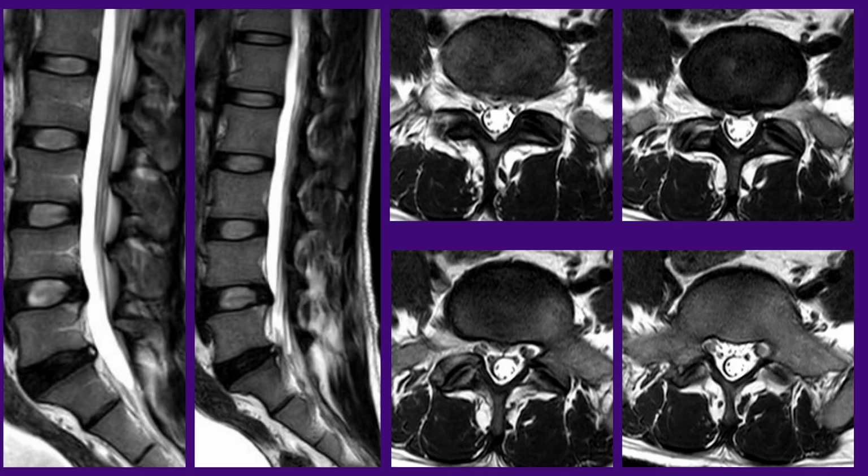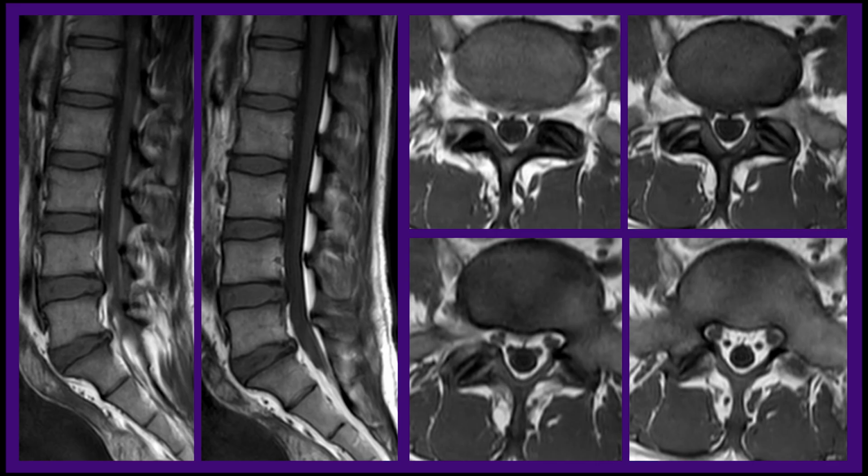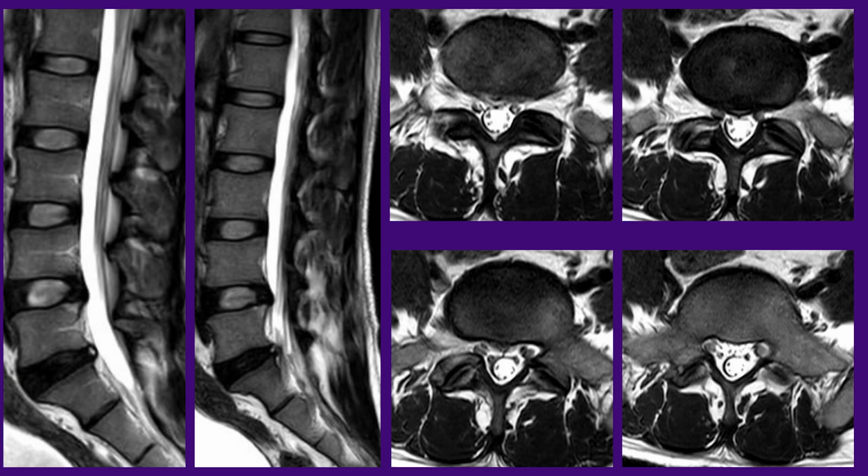So you may feel this might be a facet effusion, but this signal was white or hyperintense on the T1 image as well. So I don't know why that facet was showing hyperintensity in both T1 and T2. Again, on the right side you can see the root is getting compressed between the disc and the superior articular process.